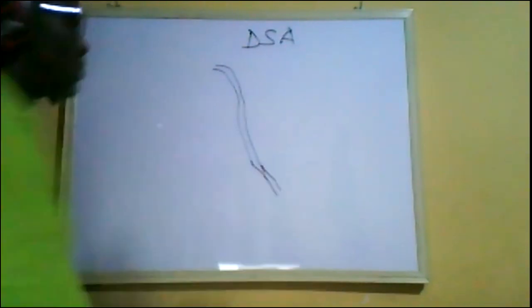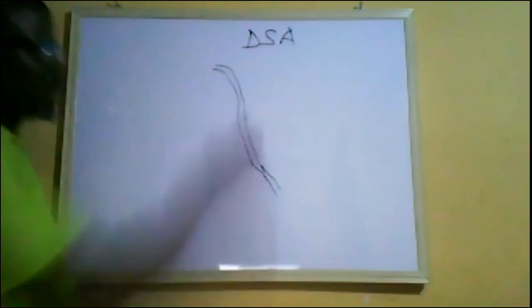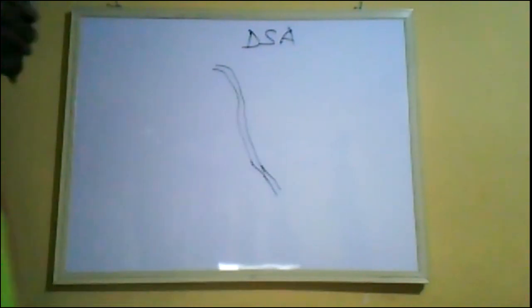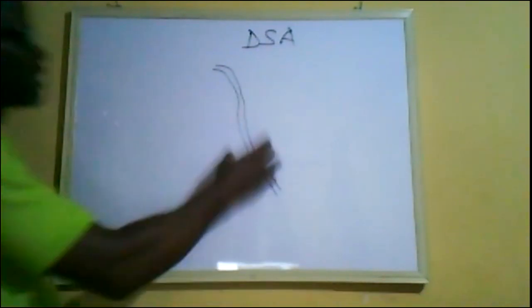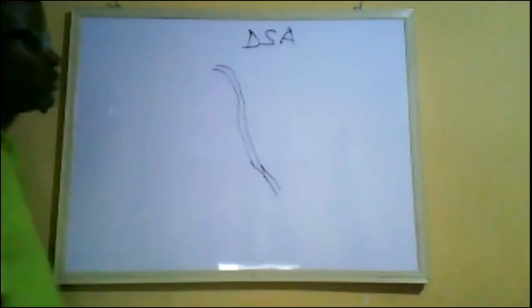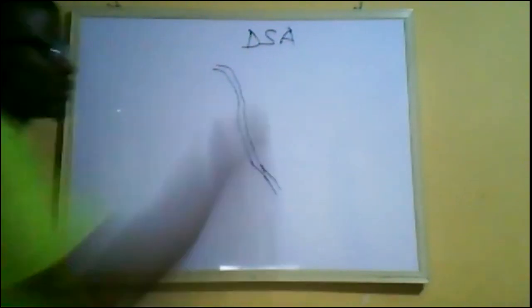Let's say the blood vessel. The blood vessel is captured as a last frame hold. Then this one will now serve as a roadmap. The image will be there on one computer, and this one is just one computer.